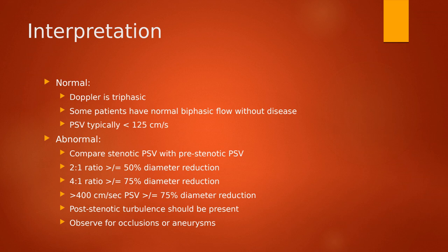Pretty standard in terms of the technical protocol of doing an arterial leg. We should be familiar with this anatomy. There's some slight differences between the venous and the arterial evaluation and interpretation, but really make sure you're understanding the new information from these PowerPoints. Make sure you understand grafts. Make sure you understand the difference between an AV graft versus an AVM, right? An arterial venous malformation. Make sure you understand how we evaluate a stenosis and what all of these numbers mean in terms of scanning.